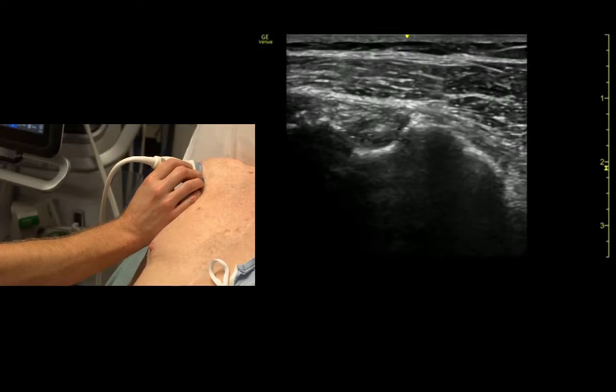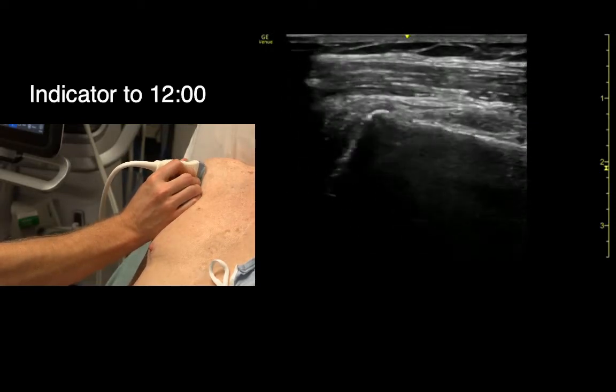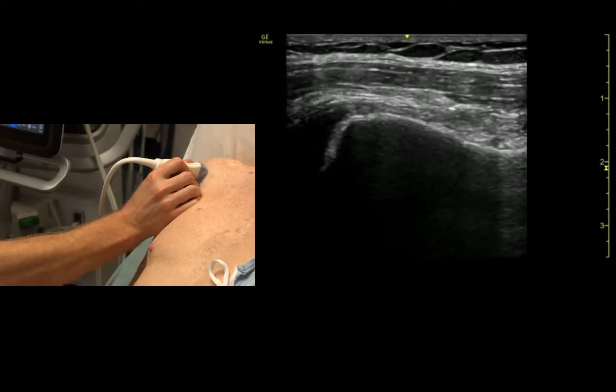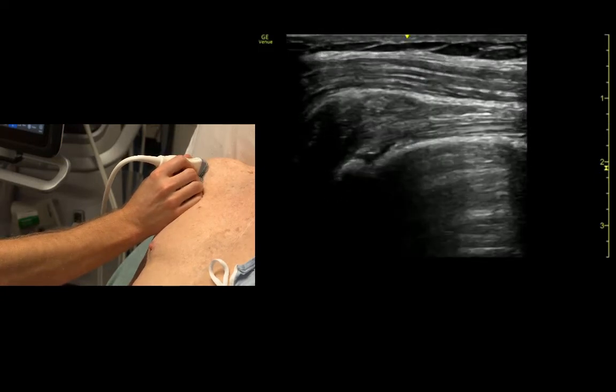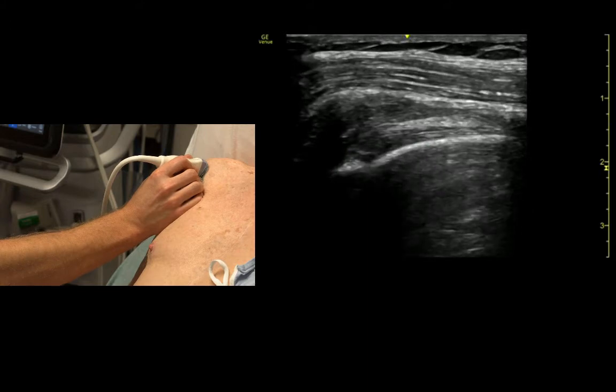If we rotate clockwise we can identify the bicipital tendon in long axis, sitting in the bicipital groove.